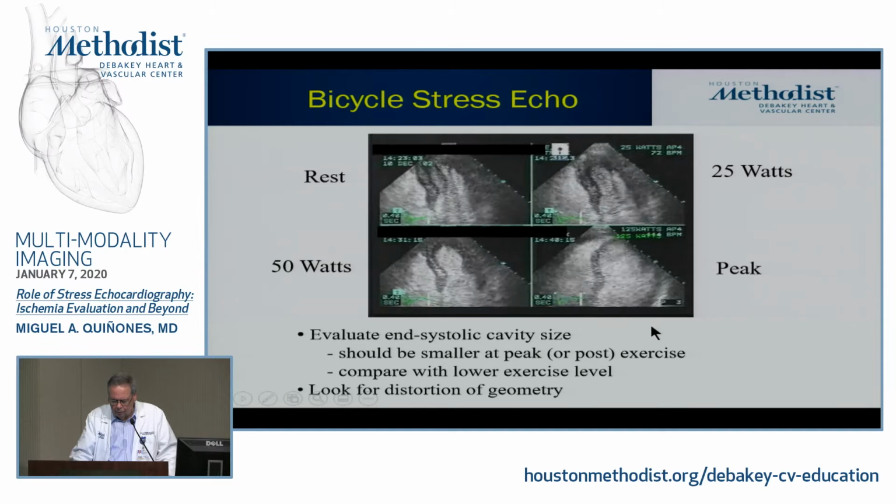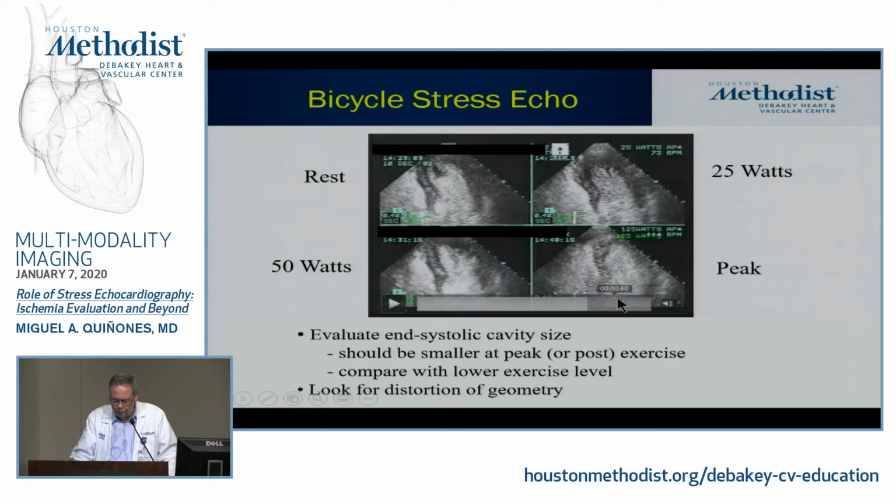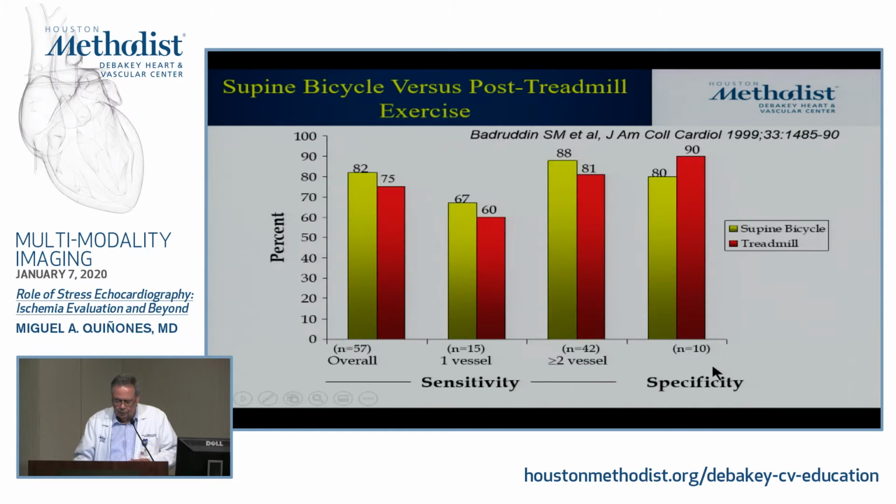I would say probably even global, because if we were to trace, the end systolic volume would be bigger here than here. So I think it was even global. Okay. Right? And this guy did have a dominant circ.